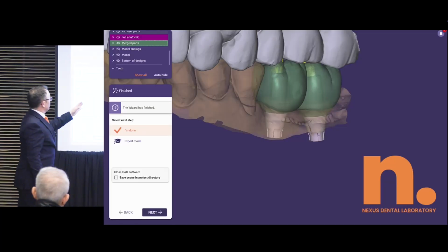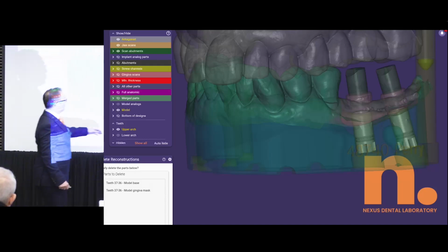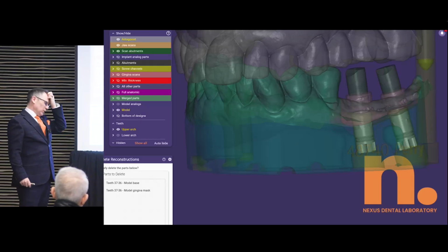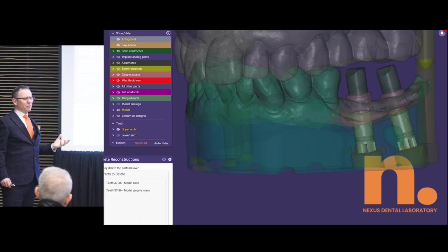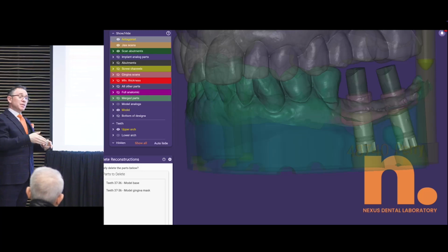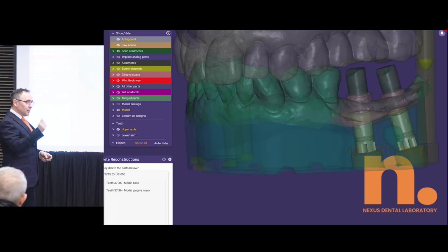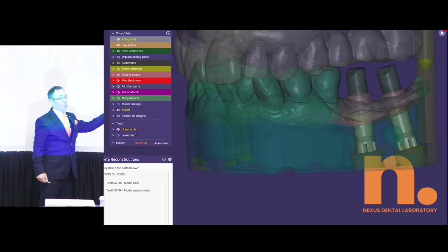So we've planned it, we looked at it, I discussed it with Martin, and then of course we go and we build the models. Now look at that analog. Boring geek that I am, I looked at that analog and I thought, it just seems heavily overcomplicated, massively over-engineered. Most of them you see, they're just very simple geometries, but there's a reason for that. That's a production decision. It's so much easier and faster to turn out simple analogs. This one is a lot more time consuming.